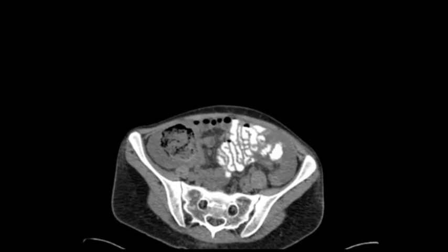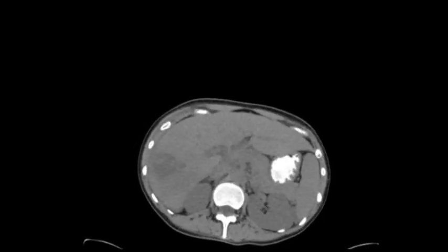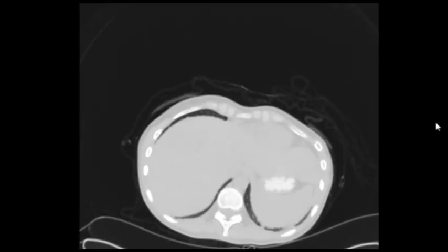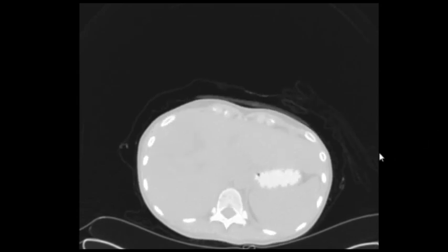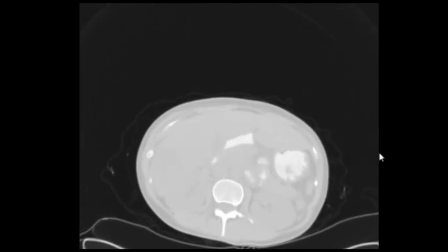And if we did not give oral contrast, how can we exclude bowel injury? If there is free air, you do a lung window on the abdomen, always. In all cases, but especially in trauma cases, look for air outside the bowel loops. Even a tiny bubble indicates some sort of bowel injury. So I'm scrolling through the lung window, looking for any extraluminal air bubbles.